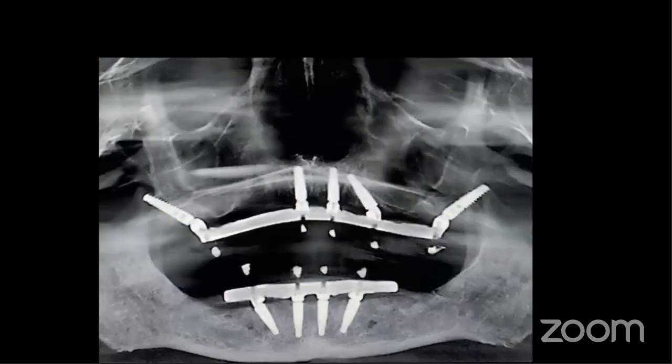What we did in this particular case was we placed a pterygoid implant on the right side. And now we take out the failed implant. We graft that site. We can extend back to the pterygoid implant because we placed a very long pterygoid implant. And now in that transitional restoration, we just extend it to attach to the pterygoid. So now the patient does not have to go with a short restoration. The patient does not have to avoid smiling because you're going to see a big gap in that area.